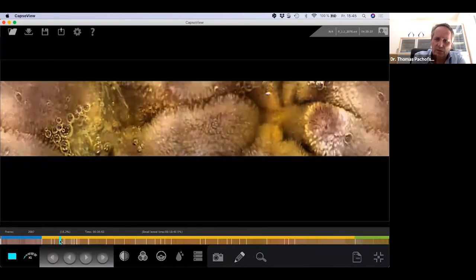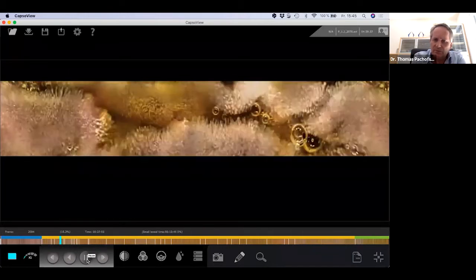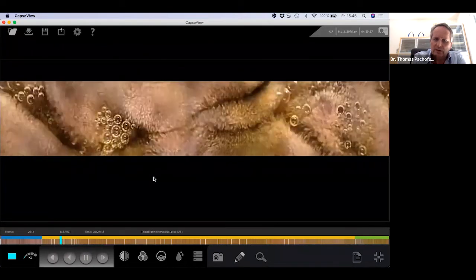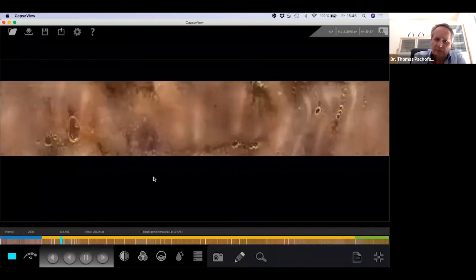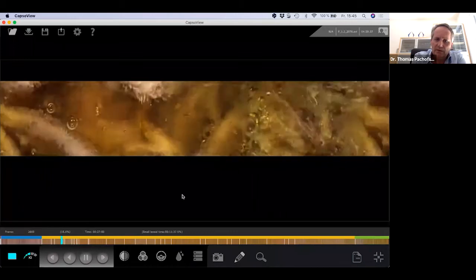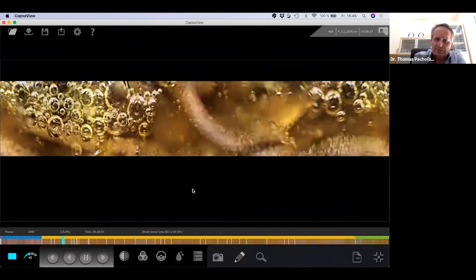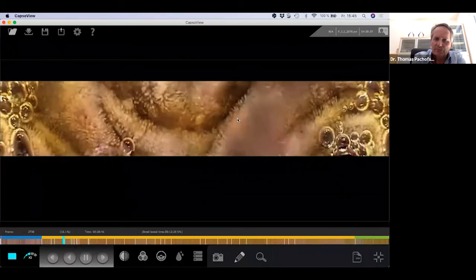So we will go on, and you can see we have here another area, which looks not as you think a small bowel has to look. And if you're going down, the situation will be clearer because we get a lot of these pathologies. So I'm going on a little bit faster so we can reach the better area.